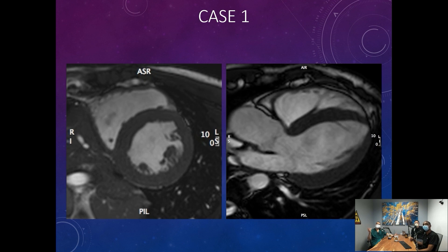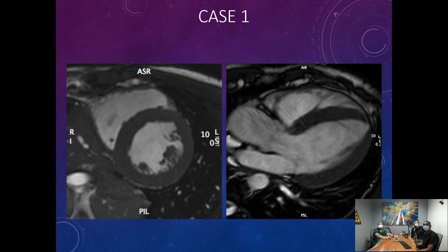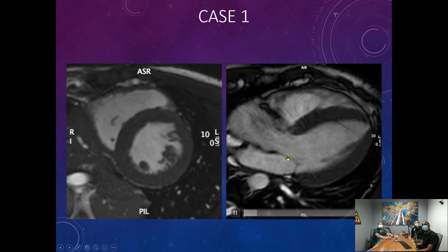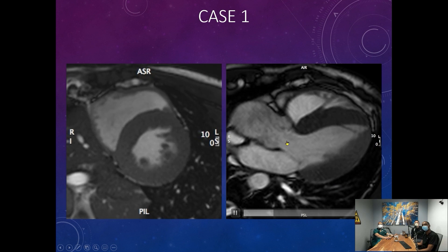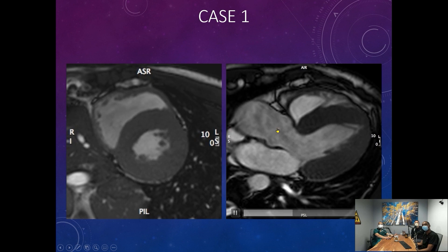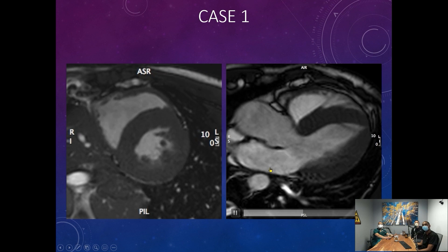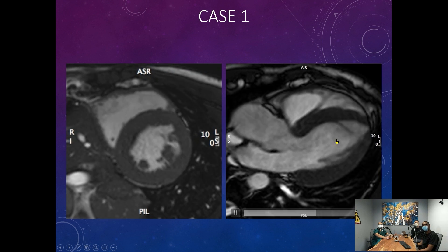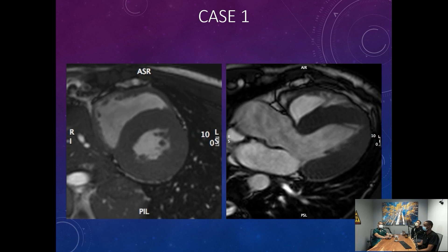SSFP doesn't show blood motion perhaps as vividly as the classic gradient echo sequence, but we can suspect there's something wrong with the aortic valve. There's a little bit of leakage — you can see spin dephasing here in diastole. The aortic root looks a little generous; normally the aortic root and left atrium are roughly equal in size, but here the aortic root is bigger.